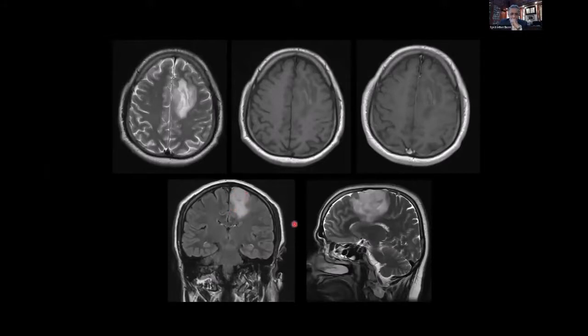And this is a T2 sagittal, where you see that the lesion is actually extending all the way into the corpus callosum also, and is showing some mass effect, pushing the posterior part of the frontal lobe back over here. And this is a low grade glioma because it's not enhancing, and it has this kind of a margin, this kind of shape.